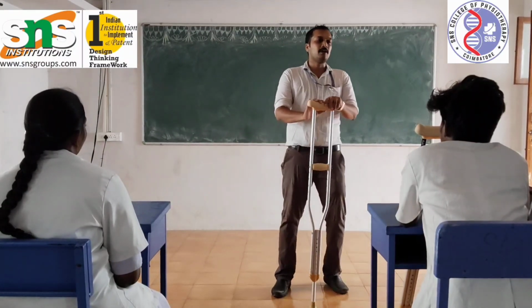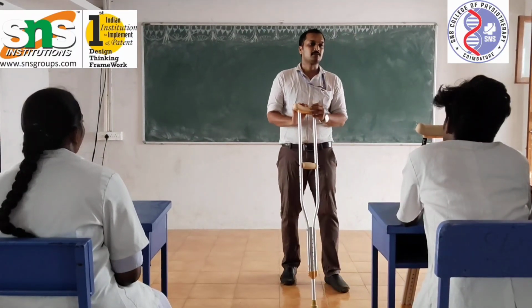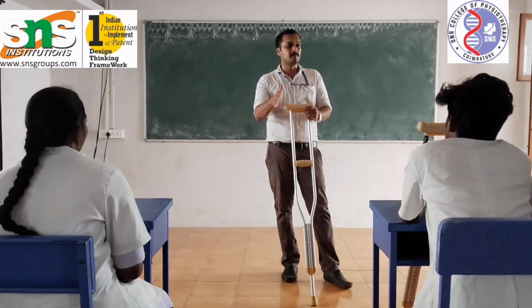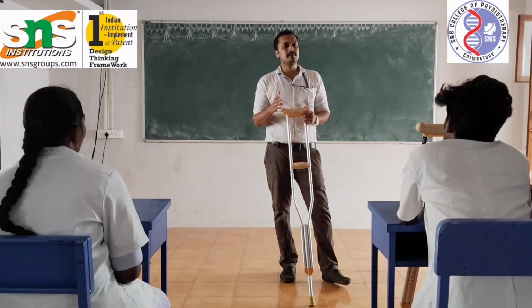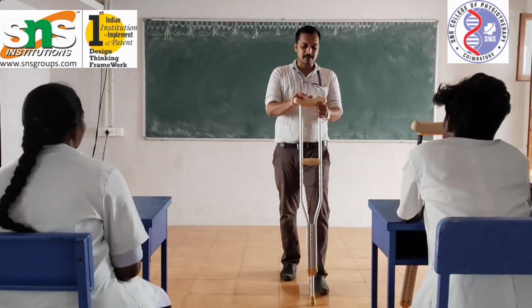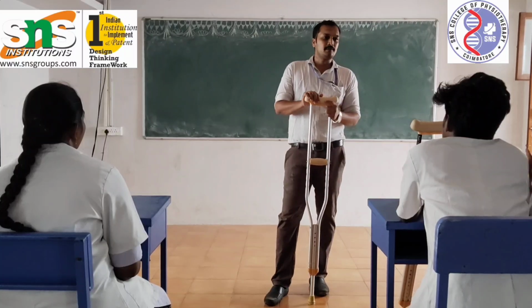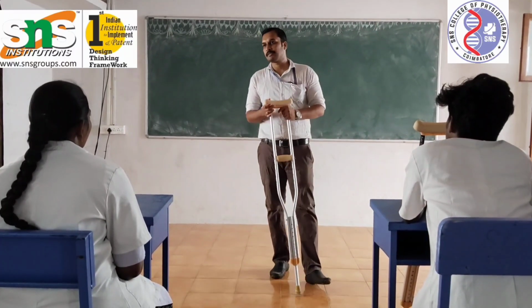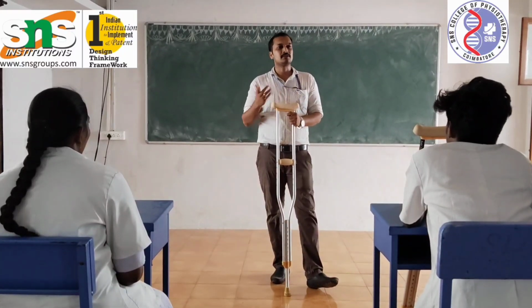Okay. Next we have to know about the measurements. Only after knowing the measurements can we prescribe the exact measurement for the patient, because each patient is of a different height. For measurement, there are ideal positions, lying and standing. So we can measure in lying and also in standing.